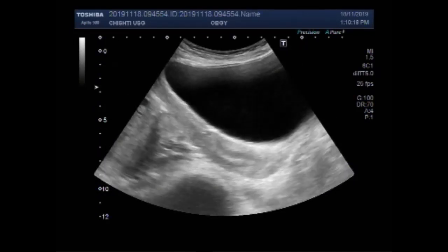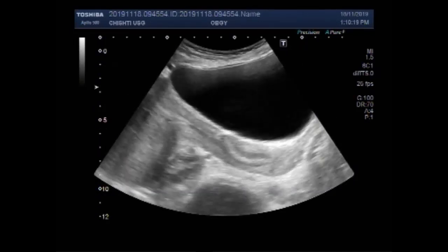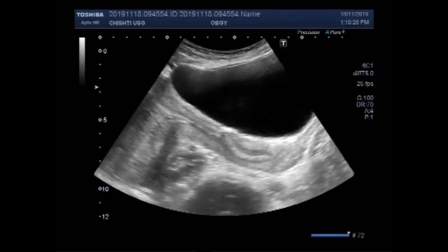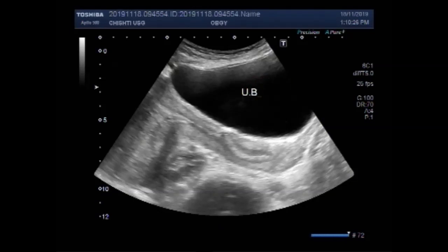This ultrasound video shows a non-viable pregnancy. You can see this is the urinary bladder, this is the uterus, and this is the cervix.